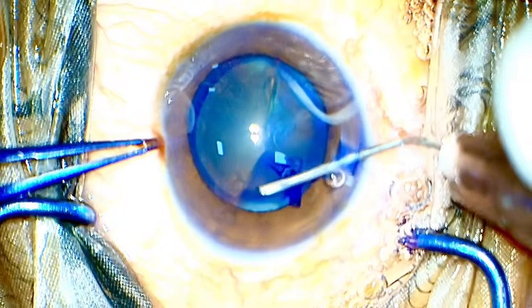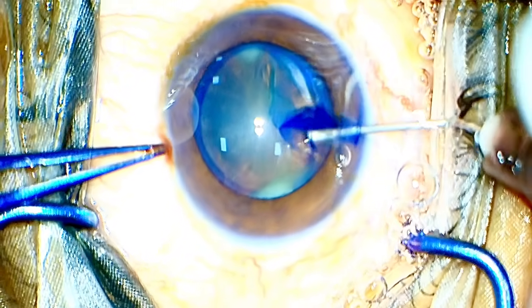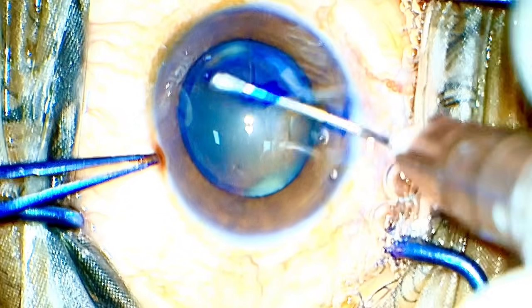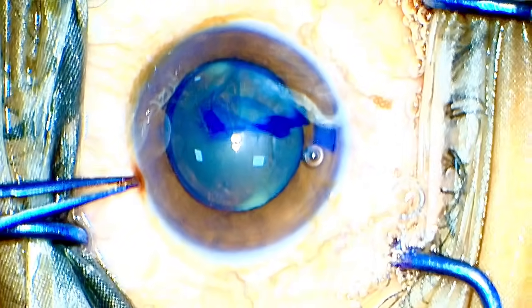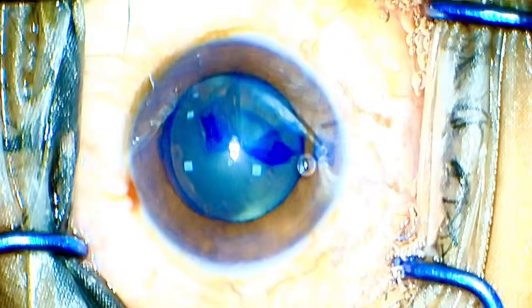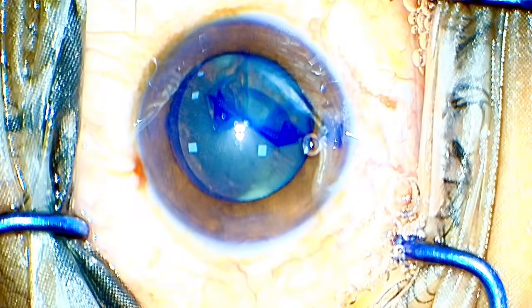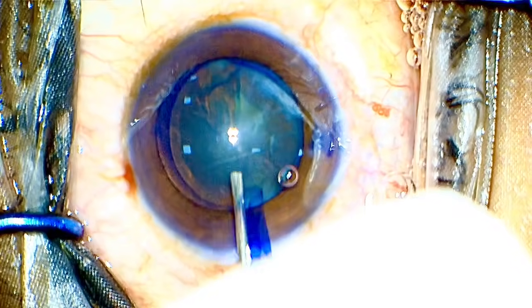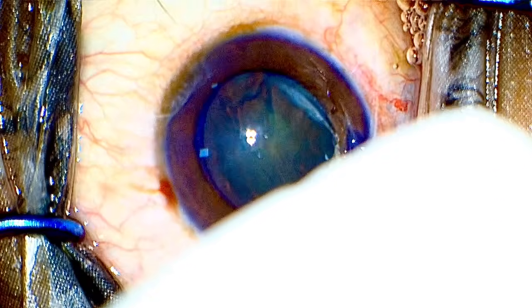Direct chop works beautifully in age related cataract that are 90% of your workload. But as this diabetic pandemic increases in the whole world, you need to know alternate strategies to develop and operate these cases as safely as you can. So for flip and chop, as you know, you should do a good hydrodissection so that one pole of the nucleus prolapses out of the bag.